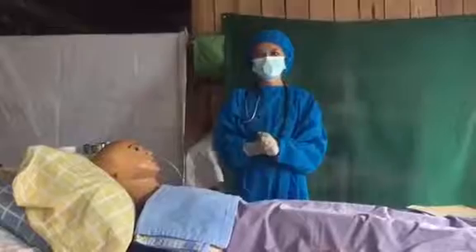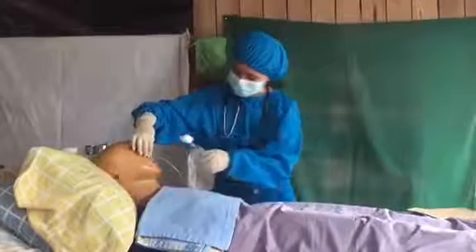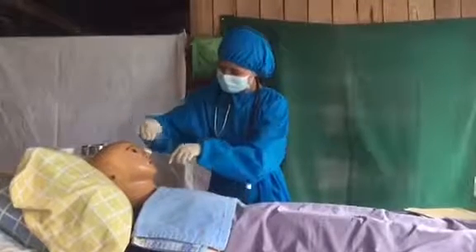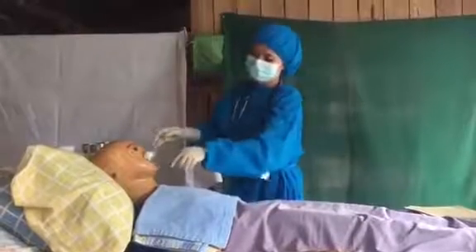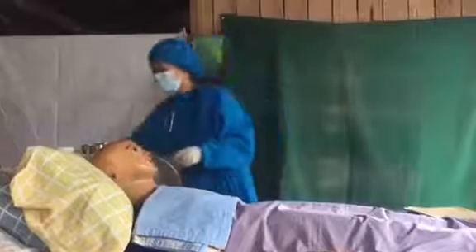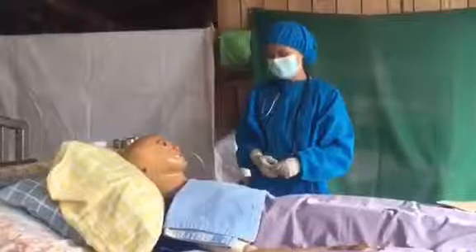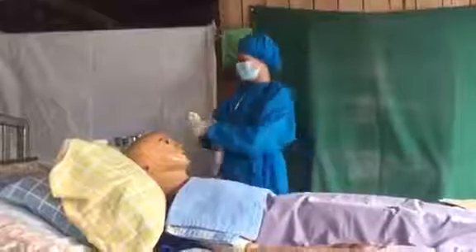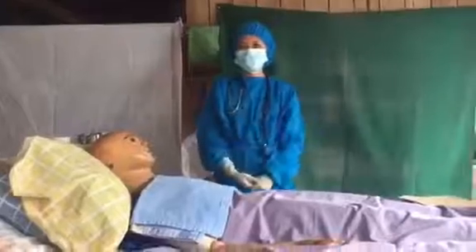So now let's go to the removal of the NGT tube. So get the forceps with a cotton ball and remove the plaster around the nose and clean it with a cotton ball. Then, okay, so done removing the plaster and cleaning the nose. Ma'am, in a count of 3, I'm going to pull out the tube. Ready? 1, 2, 3. So make sure that the patient should not see the tube after removing it. And now we're done removing the NGT tube.